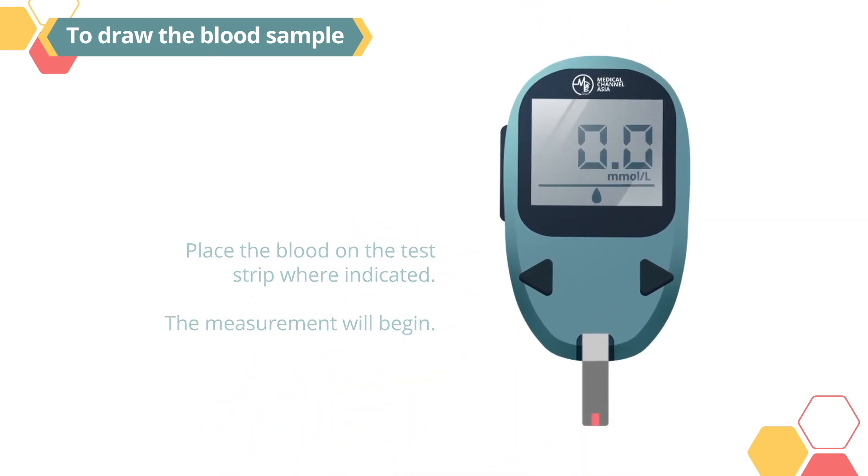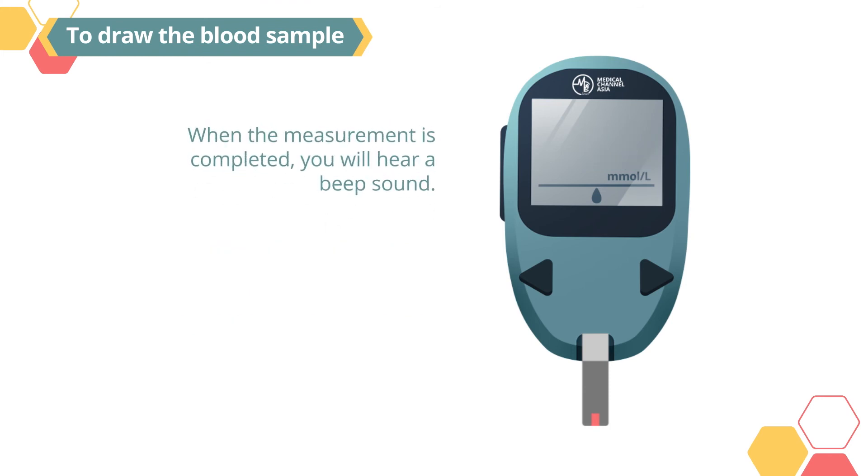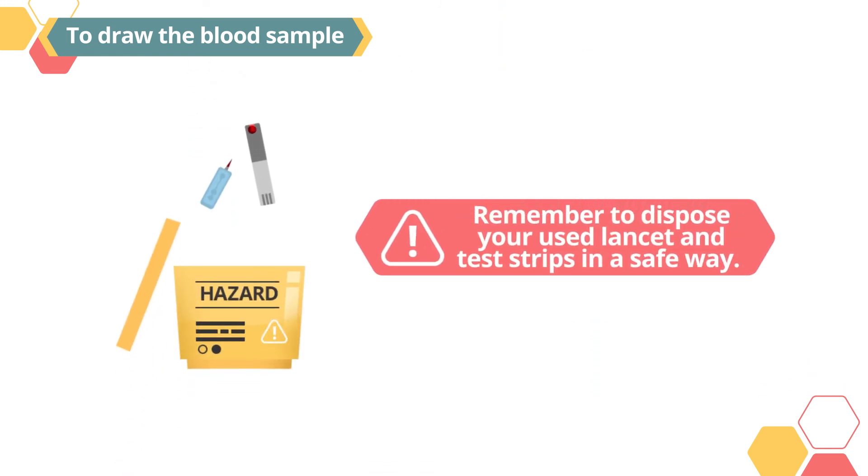Place the blood on the test strip where indicated. The measurement will begin. When the measurement is completed, you will hear a beep sound. Read your results on the display window. Remember to dispose of your used lancet and test strips in a safe way.